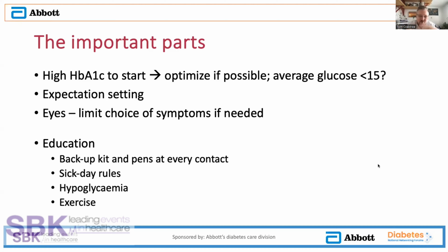and saying, look, I know you'd rather have this one, but perhaps for the first 4 years, if we put you onto CAM APS, we can set a target of 11 and then we can optimize things slowly. 4 years down the line, you'll be much closer to target, and then you can have a broader choice of pumps if you wish. So that's one of the things that we've done locally. You can try the other pumps with perhaps softer settings. It doesn't always work because of the learning they do, they're constantly trying to drive you down to a lower target, and that can be really risky.